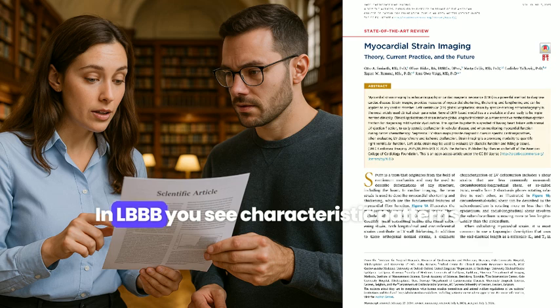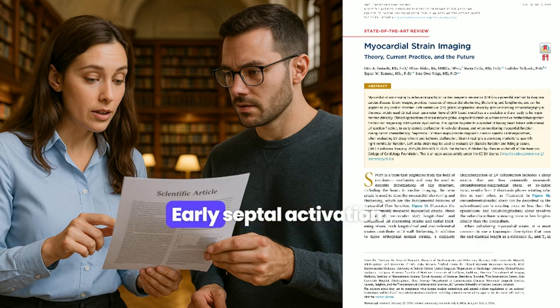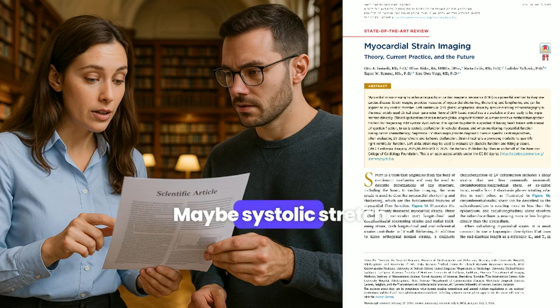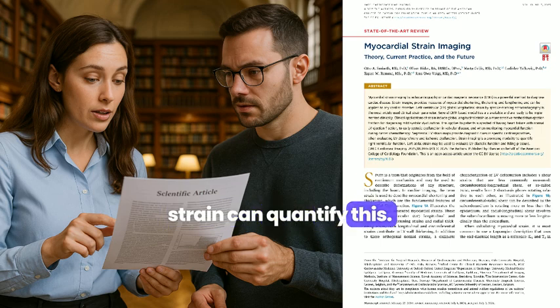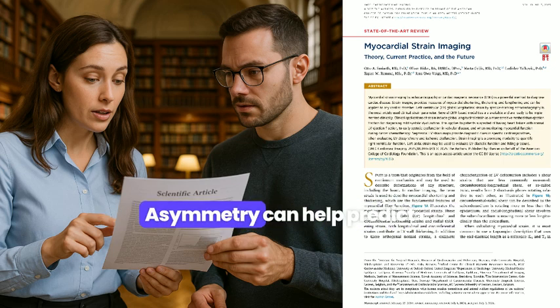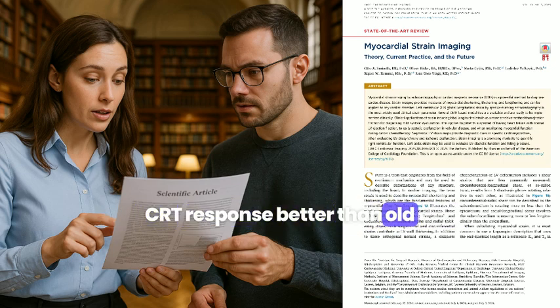How? In LBBB, you see characteristic patterns: early septal activation, sometimes a septal flash, delayed lateral wall contraction, maybe systolic stretch. Strain can quantify this. Patterns like the systolic stretch index or measures of myocardial work asymmetry can help predict CRT response better than older methods.